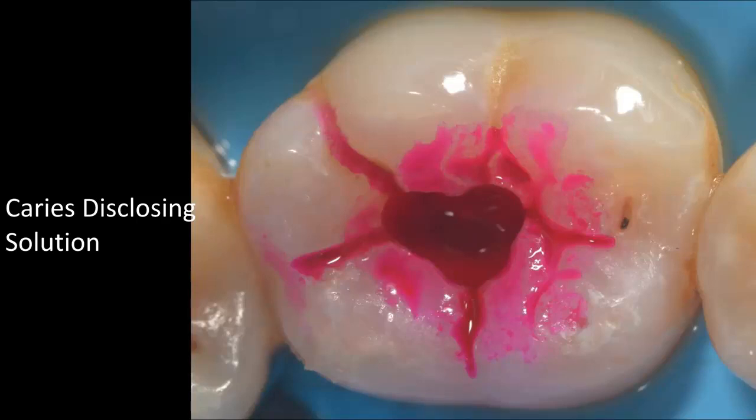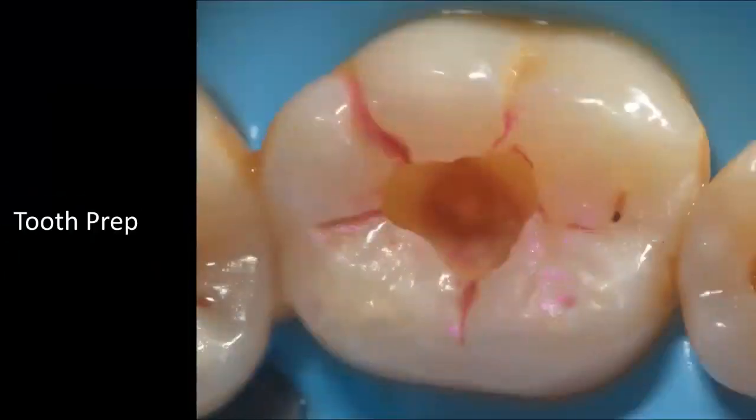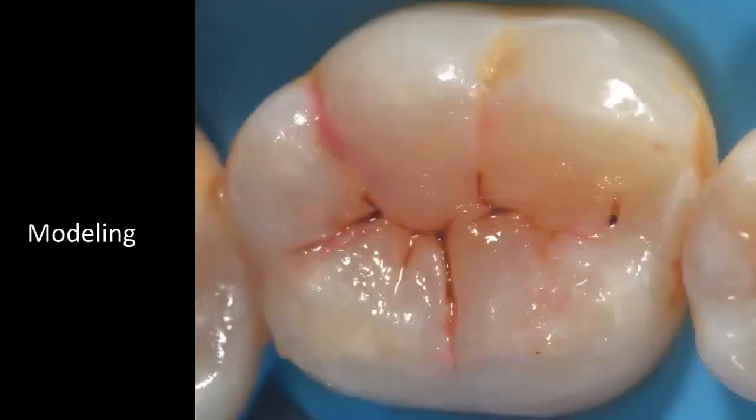Remember at this point that whenever we apply the disclosing dye, we are supposed to apply it for 10 seconds and then wash it thoroughly. After washing, if the dye is retained in areas, these areas are meant to be carious. So you are supposed to clean these areas very cautiously, under observation, so that we do not remove further area. Remove these areas in which the dye has stuck and then start filling.